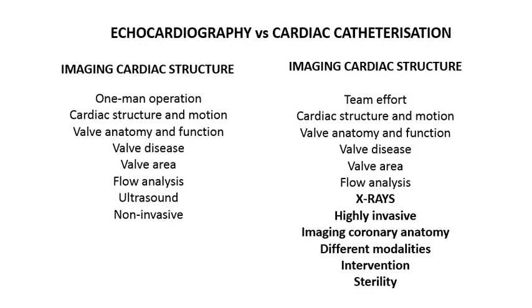The differences arise in the actual mechanism of imaging. In echo, you use ultrasound, which is a non-invasive procedure, and that's basically it. Whereas in the cath lab, it's a highly invasive procedure requiring X-rays, and that brings in a whole new dimension. It requires a special dedicated laboratory with protective shielding and restricted entry, as in radiology laboratories. The principal mainstay of cardiac catheterization labs is imaging coronary anatomy for treating coronary artery disease, one of the biggest killers in our society.